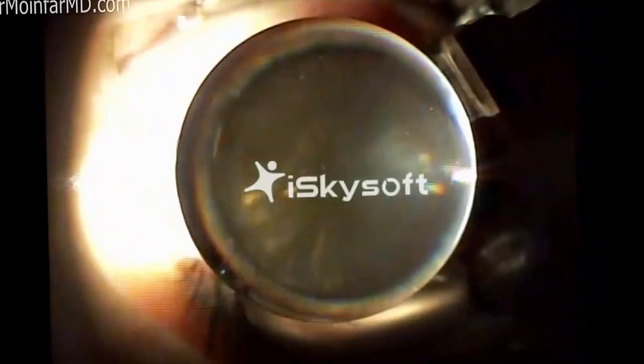It's actually quite unusual, especially with the 25 gauge system that you see being used here. Now again, I'm switching some instruments here, maybe just switching from my left hand to the right hand. And now you can see the light pipe is coming out of the right and the vitrector is back on the left. So again, what I'm trying to do here now is make sure that all the traction off the retinal detachment is being released.